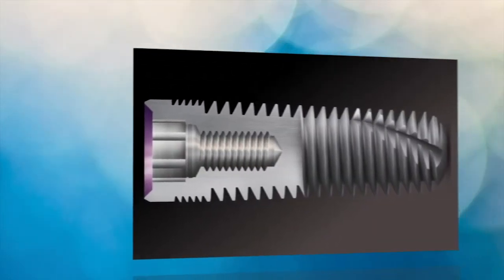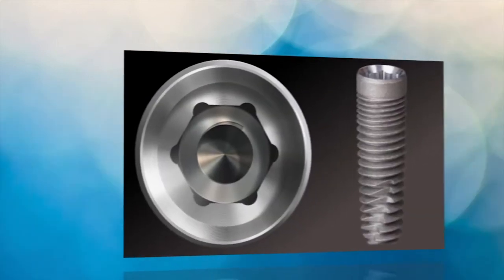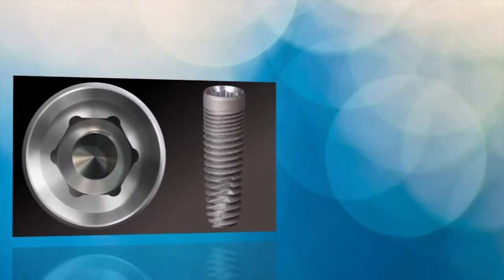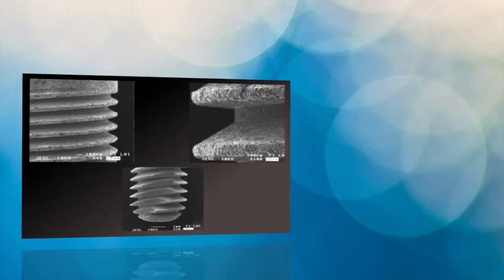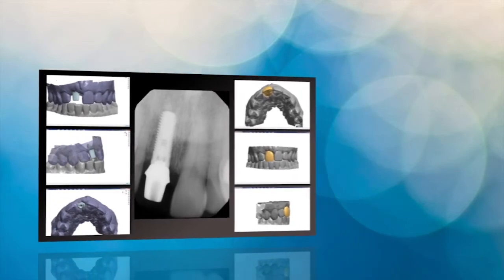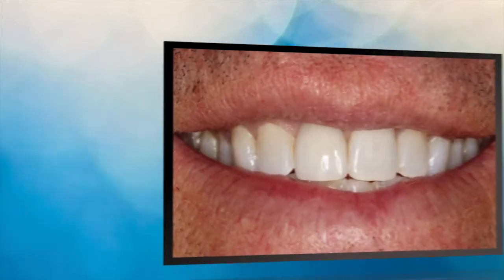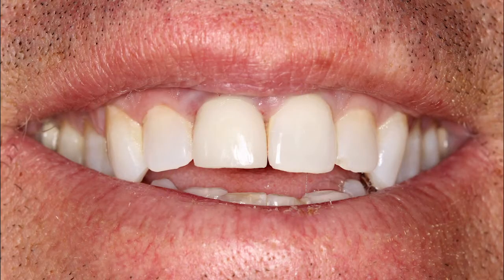The creation of internal retention designs in the implant body, such as notches, Morse tapers, and internal hexes, further improved outcome. As restorative outcomes have become more predictable, expectations for implant cases have made a substantial shift towards aesthetics. So let's look at the figures.